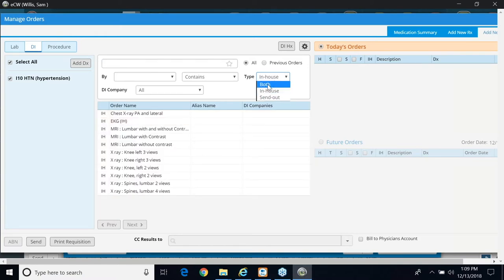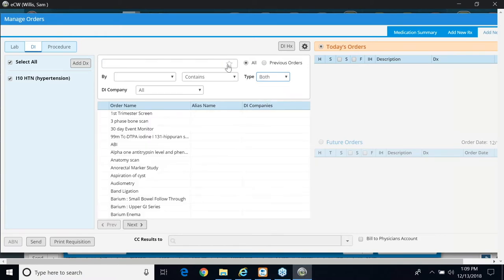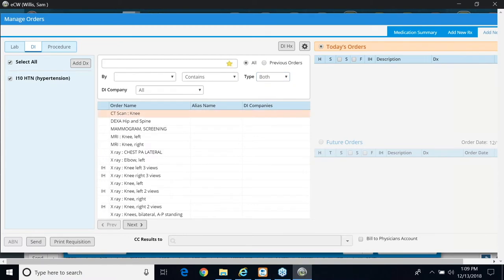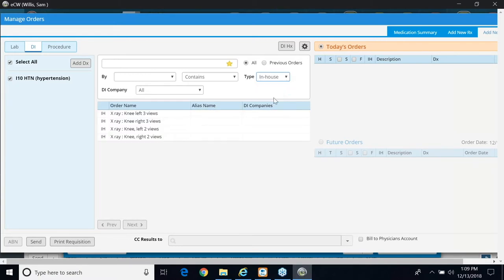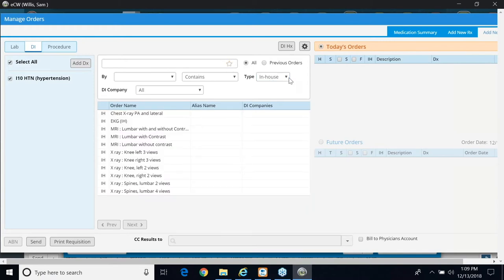Or if I change it back to both, I also have the ability to select my star, which indicates favorites. Oops, look, I didn't do it. So I'm going to come back, click in-house, and here's my EKG.